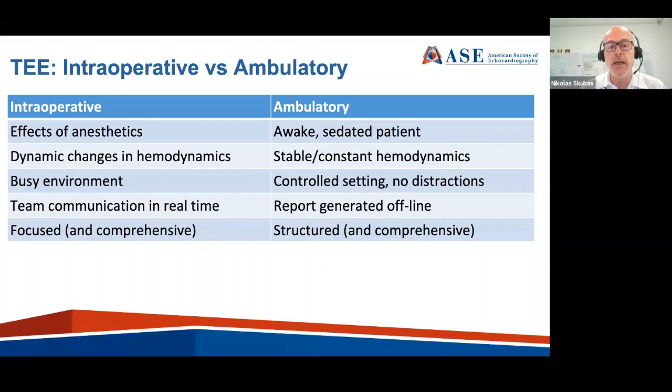At the same time, the exam is not always well structured and comprehensive, but maybe going back and forth from A to Z and backwards, trying to be focusing at different times on different structures, depending upon what the question may be from the other side, from the surgeon, or what else may be going at the same time in the operating room and on the patient. So the highlighted difference between operating room and the lab is that the exam is repetitive and at times focused, but always as comprehensive as possible.